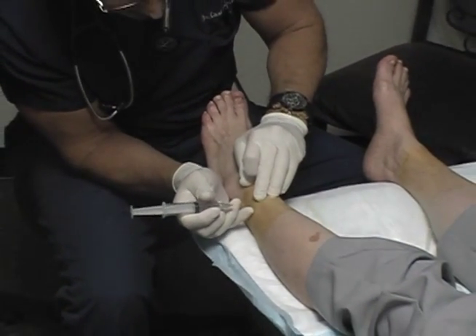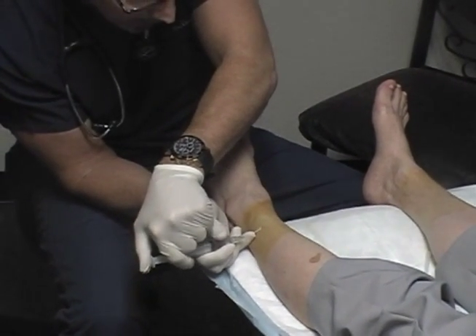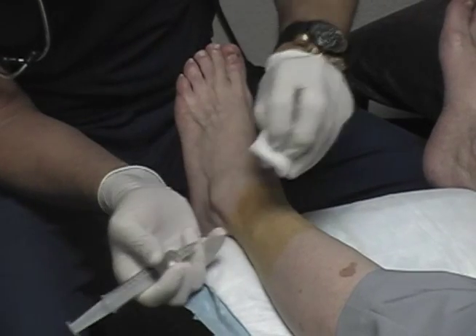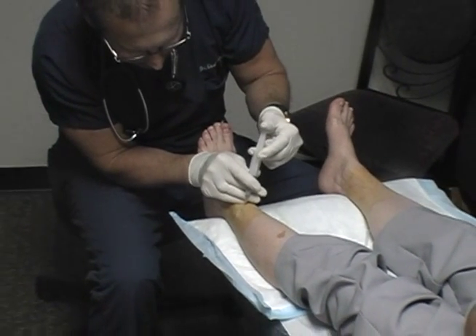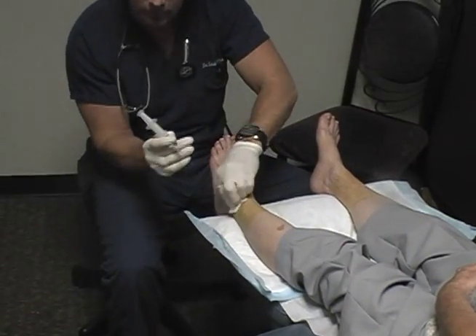Using the same entry point, I'm going to inject the medial branch of the superficial peroneal. And using the same entry point, I'm going to inject approximately one cc in the lateral branch of the superficial peroneal.